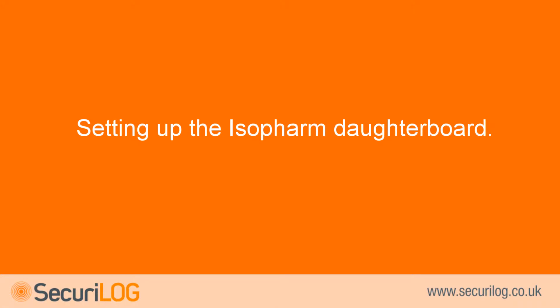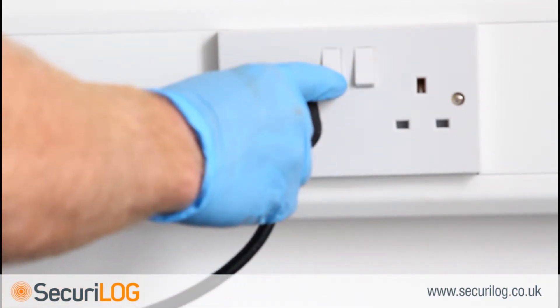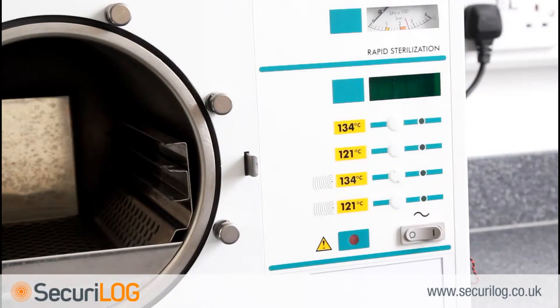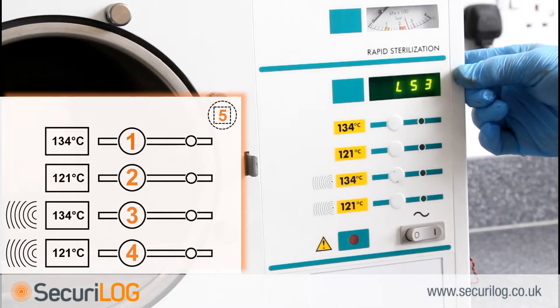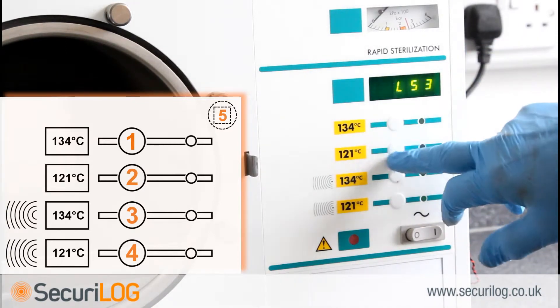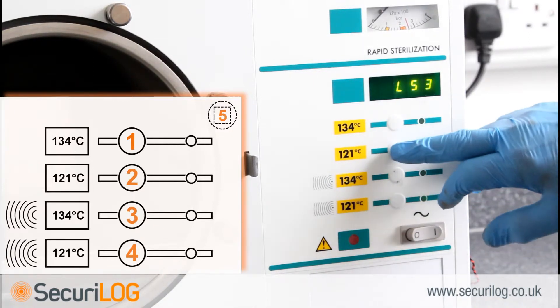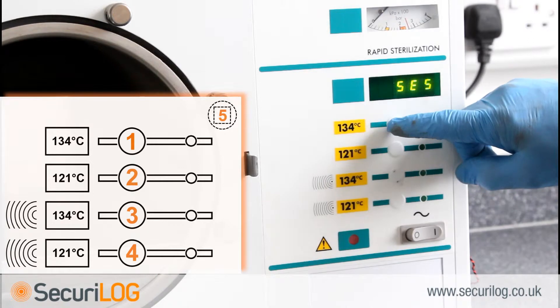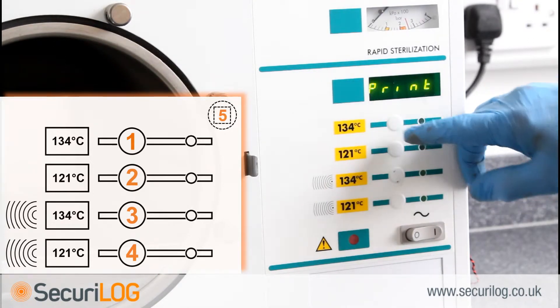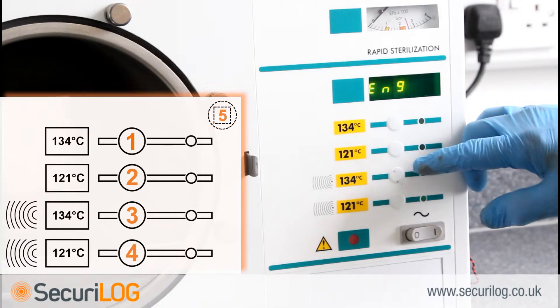Setting up the Isopharm daughterboard: to enter programming mode and turn on the printer function, plug the steriliser back into the mains — be aware that the machine is now live without the cover in place. Hold button 5 on the reverse of the front panel and switch the mains on, keeping button 5 pressed until the display reads 'set up'. LS3 will then display. If the unit is an SES-2000, press button 2 to bring up SES. Press button 1 to change the display to read 'print', then press button 1 again to change the display to read 'Psyc0'. Press button 2 — the display will now read 'ENG'.